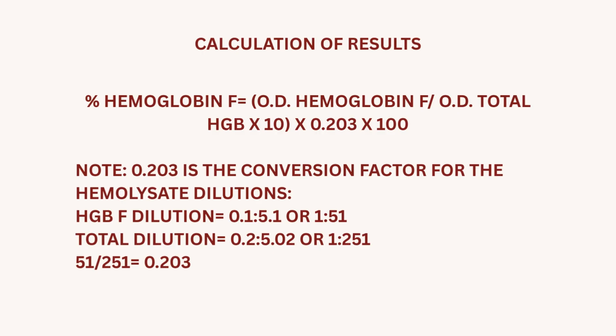So, prepare the total hemoglobin specimen for the patients and control by adding 0.4 ml of each of the total hemoglobin solutions to 6.75 ml of distilled water. Transfer the filtrates and total hemoglobin solutions to cuvettes and read in a spectrophotometer at a wavelength of 540 nanometers, using cyanmethemoglobin reagent to set the instrument at zero optical density. Record the absorbance of all specimens.